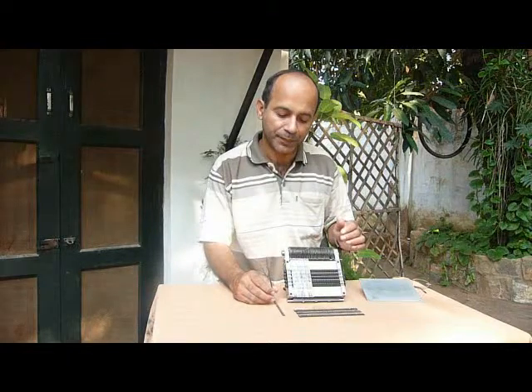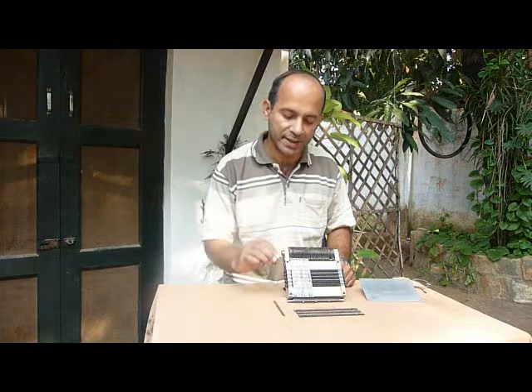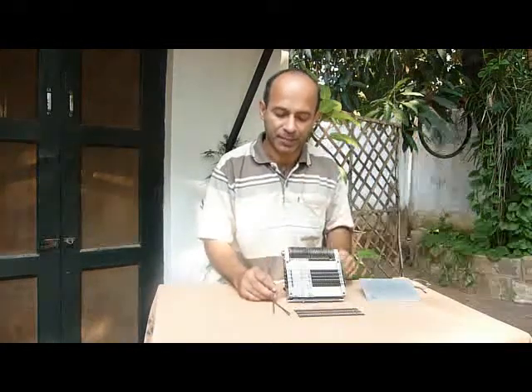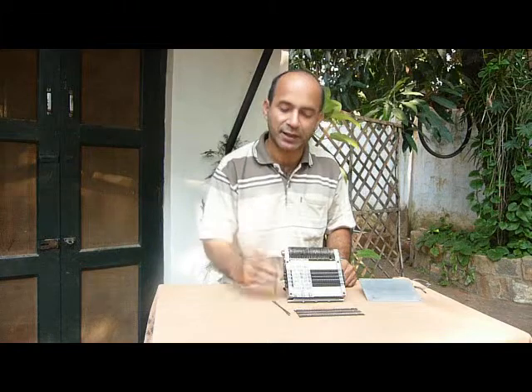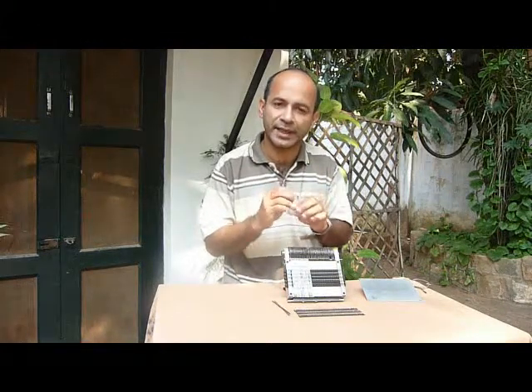To do that, the easiest way that I've discovered would be to foul the bore in which the pin passes up and down. To lock it, you just get something in to foul the bore. And that I've done using these little slides, where the bore passes through two plates. Between the two plates, we've got a slide that goes in and inserts itself a little bit into the bore and blocks the pin from moving up and down. The pin has a flange that catches onto the side of the slide, and it's either locked above the slide or below the slide, the flange.